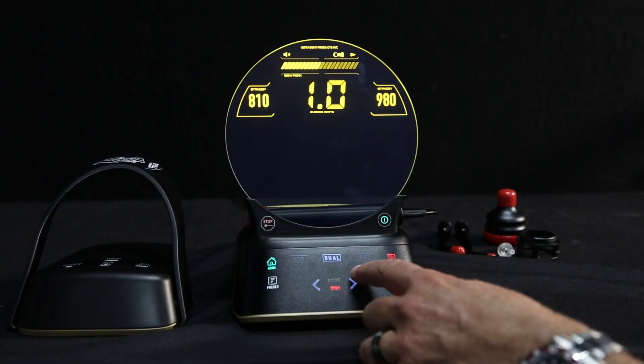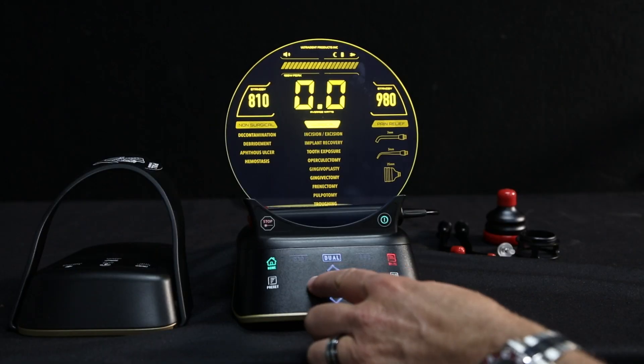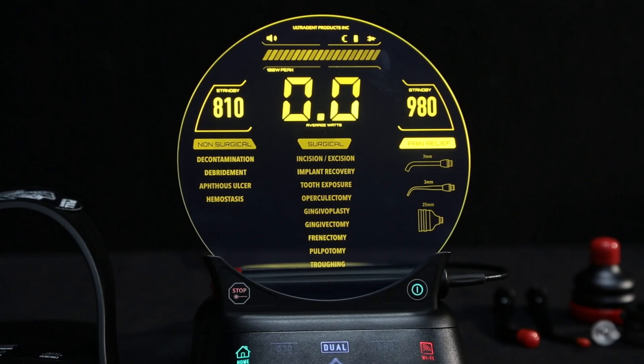The Gemini Evo comes with presets organized into three intuitive categories: non-surgical, surgical, and pain relief or PBM. All power settings can be customized on the Gemini Evo laser unit or via the dashboard. The pain relief or PBM presets correspond to the included 3 mm, 7 mm, or 25 mm adapter tip.